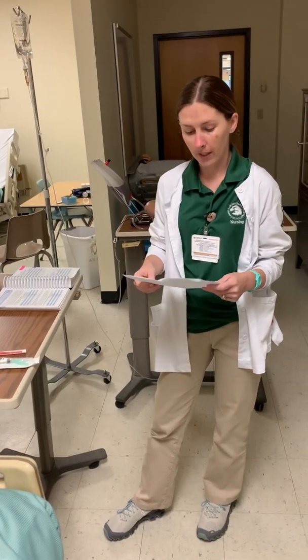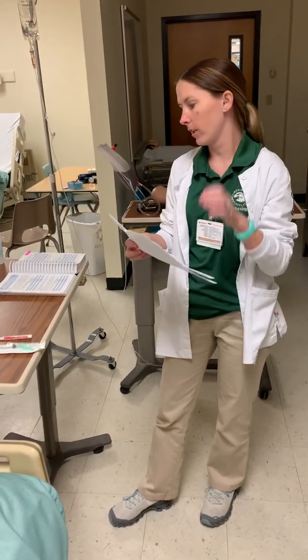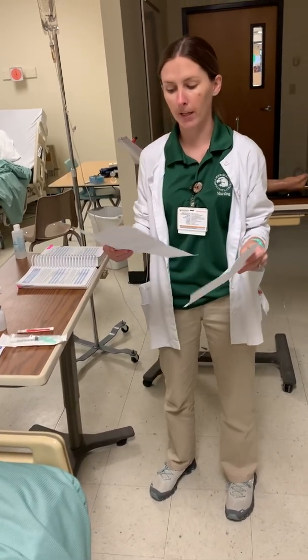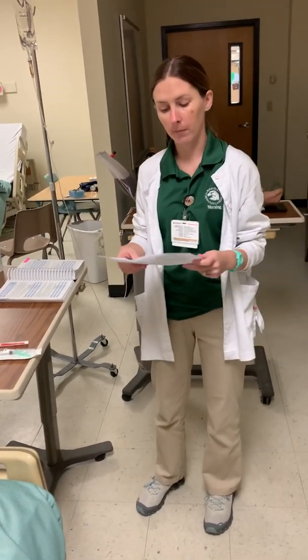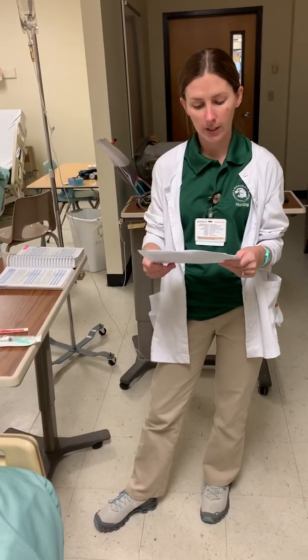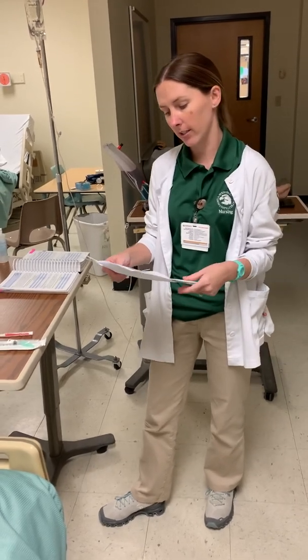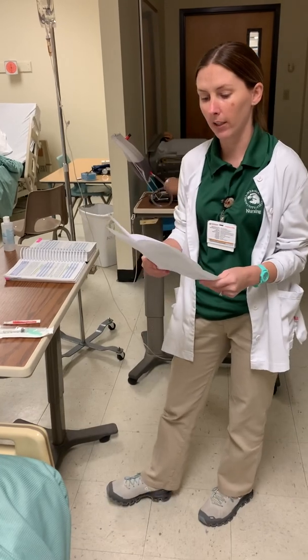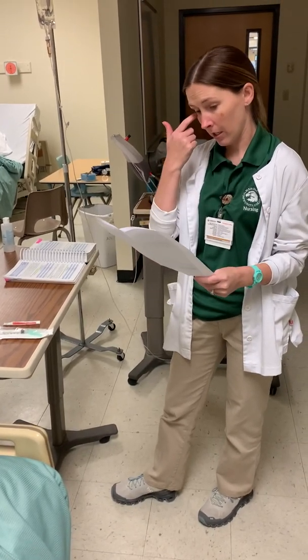All right, I'm going to be doing my IV push practice video, and I'm going to be giving digoxin. So the first thing I would do is compare my MAR to my doctor's order. I'm looking for the right time, the right amount, the right patient, the right route, and the right medication. So we're going to be giving digoxin 0.2 milligrams IV push.